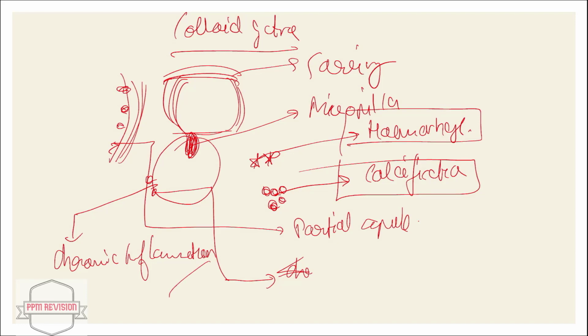Now looking at some of the points. In colloid goiter, most of the acini are distended to varying degrees. Some of them have ruptured and become coalescent with each other, and the epithelium lining the acini is very much thinned out and is represented only by a row of round vesicular nuclei.